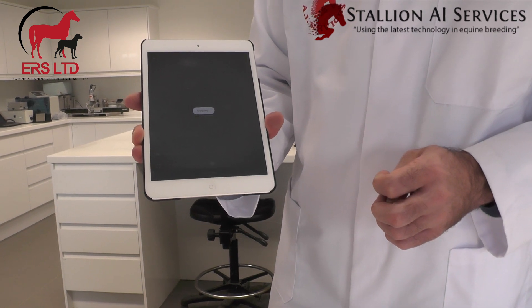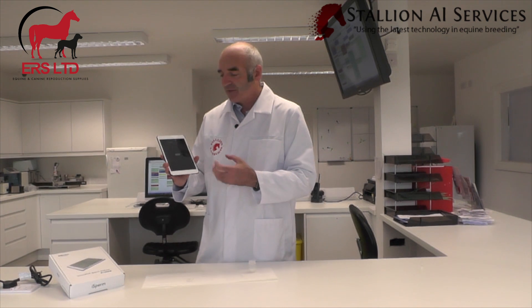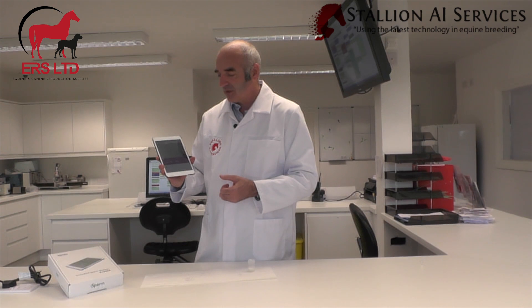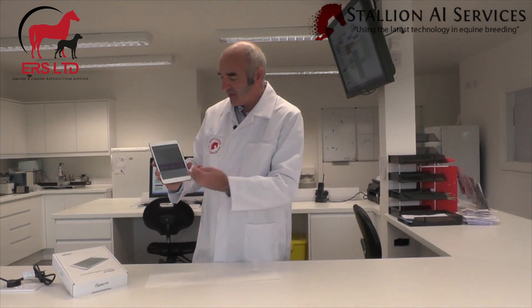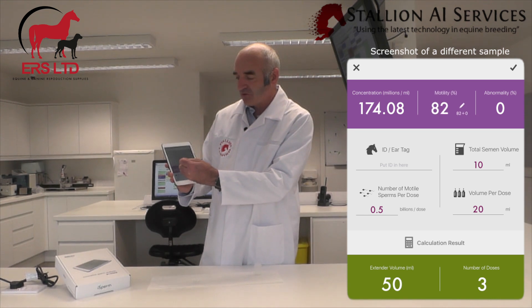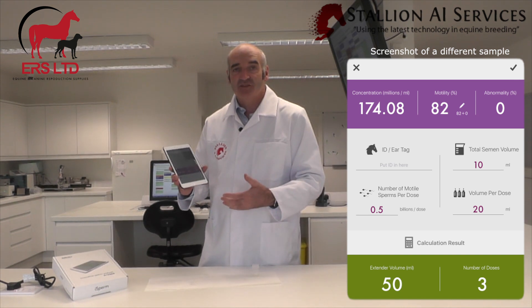As you can see here, it just says 'analyze now.' We analyze it, and it works out the actual motility and the concentration. Very soon there's a new app that can actually do progressive motility as well.